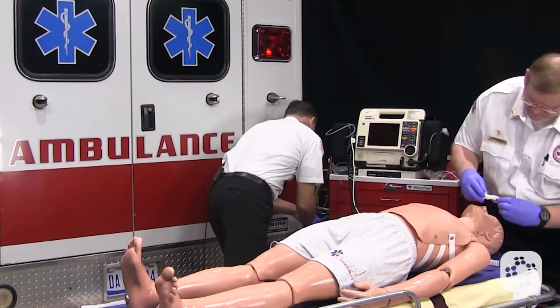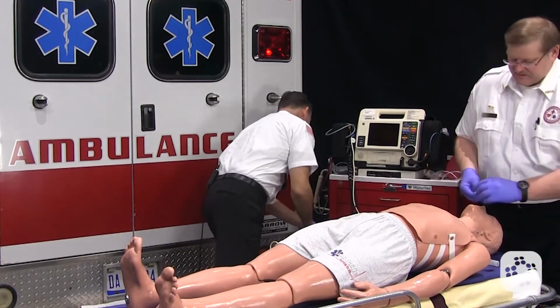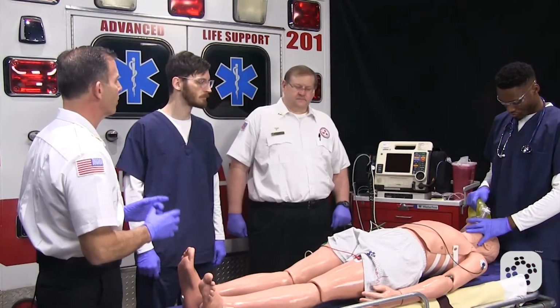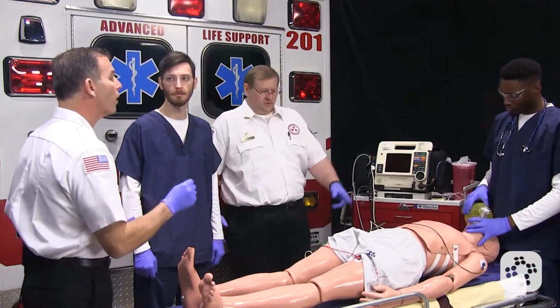A basic airway like an OPA or an NPA should be inserted. Then, we're going to start rescue breathing with a bag valve mask at 15 liters of oxygen. We're going to deliver 1 breath every 5 seconds. Remember, vitals should be taken and an ECG monitor should be attached.